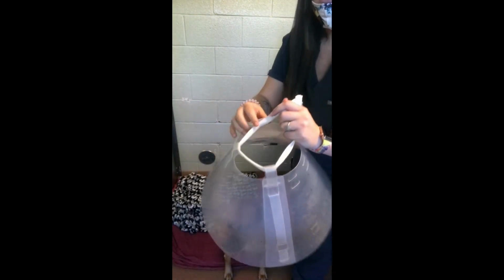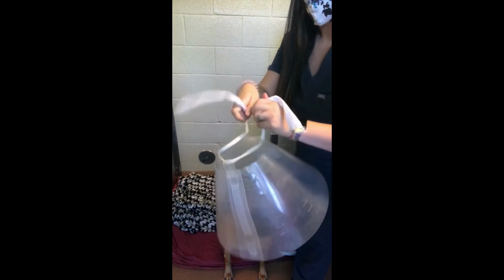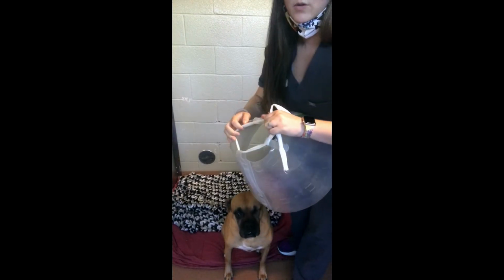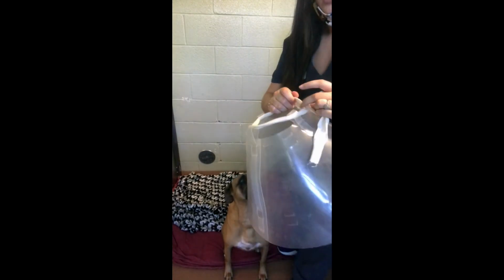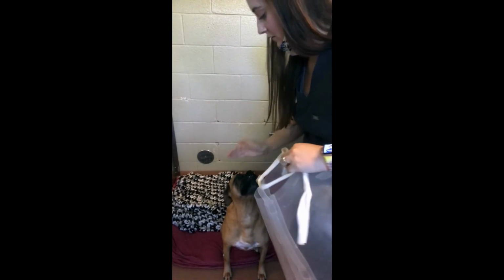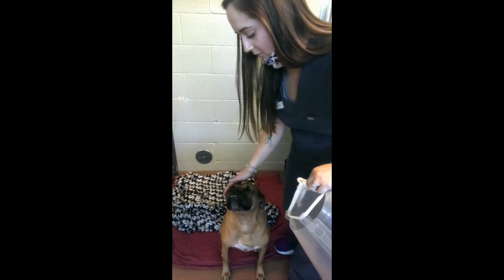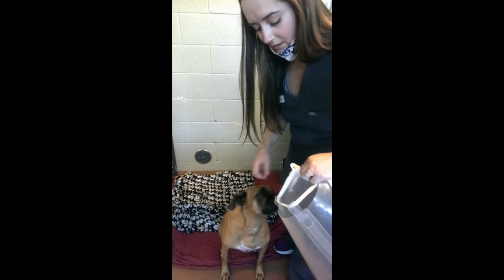You also want to get either a collar or some brown gauze or white gauze to make a makeshift collar where it can be tight enough on their neck to where they cannot get it off. And once you have all of that, we are going to gently slide this over her head, being careful not to hurt her eye or her ears or anything like that.